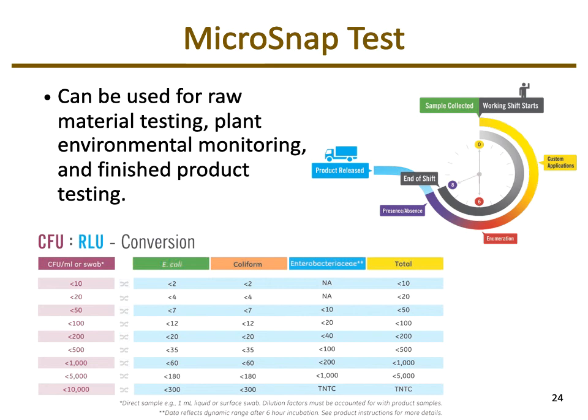And again, a huge benefit here is if you look at this figure up on the right side: you collect a sample, shift to starting, so you get raw material in, you test it, and as shift is starting they're processing it. You're already working on it, because you put that sample into that enrichment material, it's growing to the point where now you can test, and by the end of the shift you would know whether there's presence or absence of a specific microbe or what the total counts were, so that you can then release the product by the end of the shift.